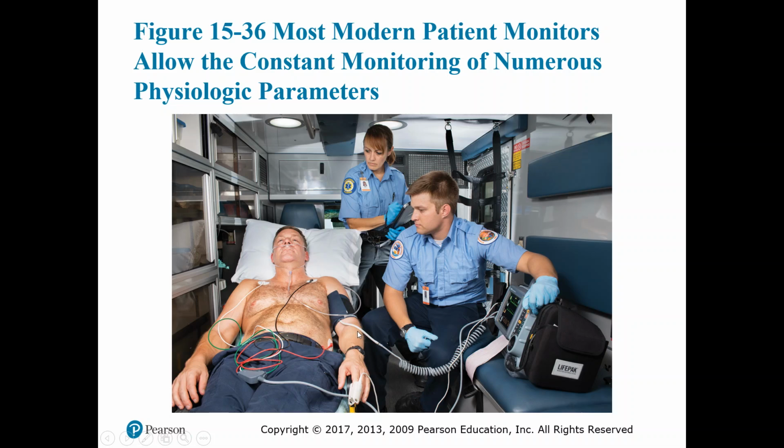Maybe that is just a regular nasal cannula, but the point of this picture is to show that our modern monitors, especially in the example of the LifePak 15, can monitor 3 EKG leads, blood pressure, and end tidal CO2, all at the same time. You can keep track of multiple parameters of the patient to get a good, solid look at what's going on with them to form your decisions.